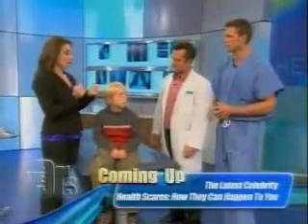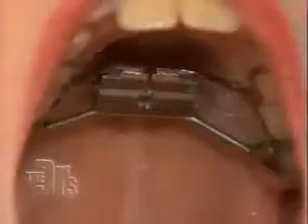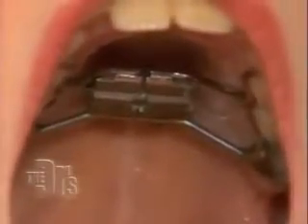Is there something you'd see with the teeth, the spacing of the teeth, that a parent could see at home? Usually they're very crowded, and usually the upper jaw is really, really narrow. And John's had his in place for how long? He just got it actually on Monday. Does it hurt at all? No? So you're fine. They just have to put cotton there and air dry it. Can we see what it looks like in there? Can you sometimes take some of the food and hide it up there for a late night snack?